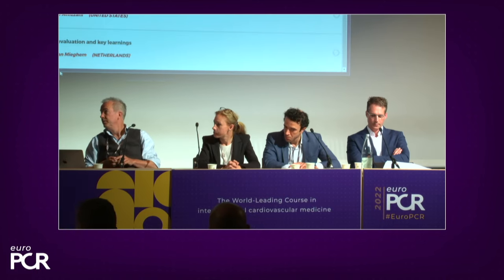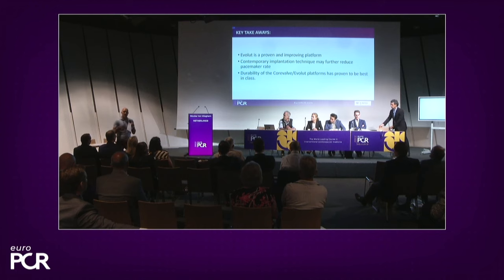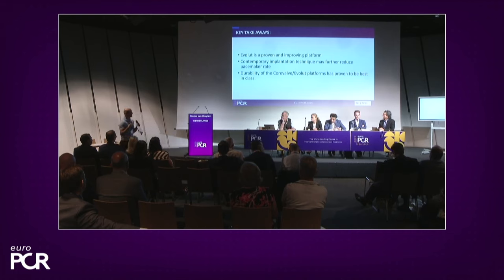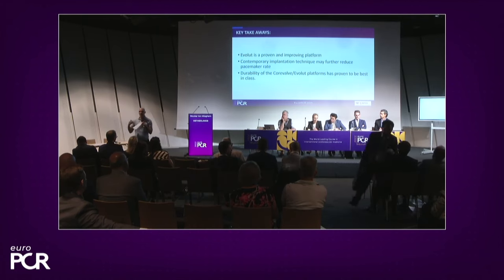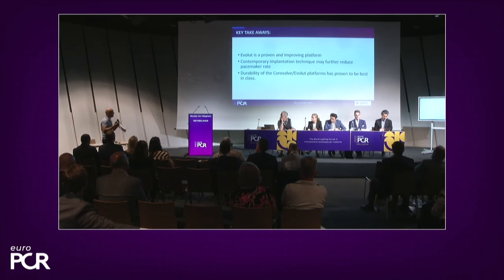Thank you. So, Nicolas, do you want to give away some key learnings? Sure. What we learned in this session is that we are moving, and rightfully so, to low-risk patients who are younger. But in that context, we have to be very considerate in terms of valve durability and longevity. And we are gathering more and more data that the Evolut Pro and Evolut Pro Plus valve, which is the valve that we have in Rotterdam for the time being, is a proven but ever improving platform. And this is very important.